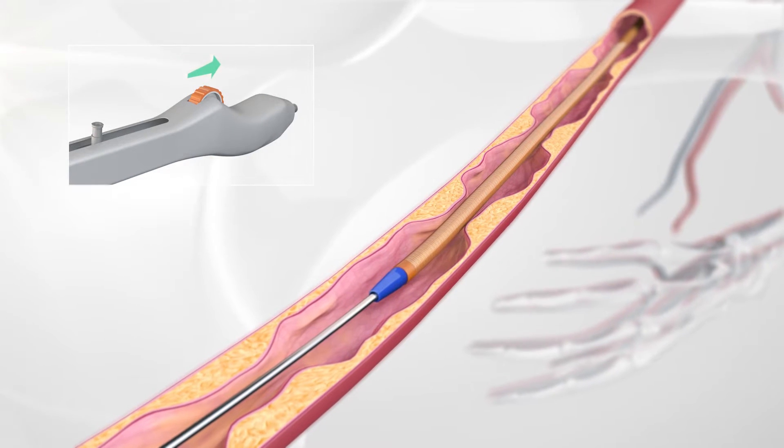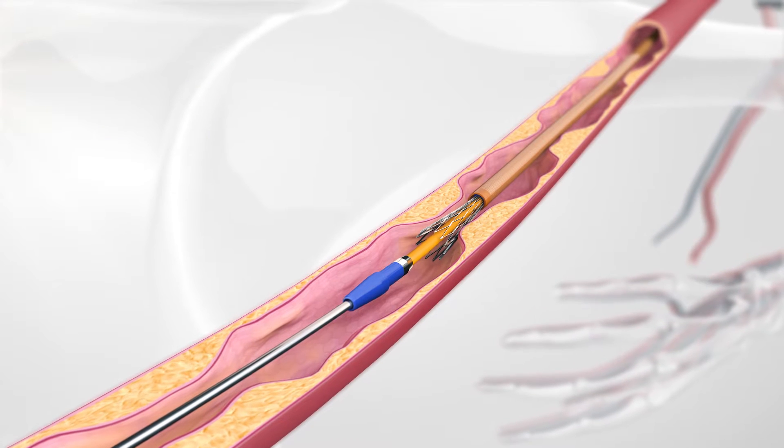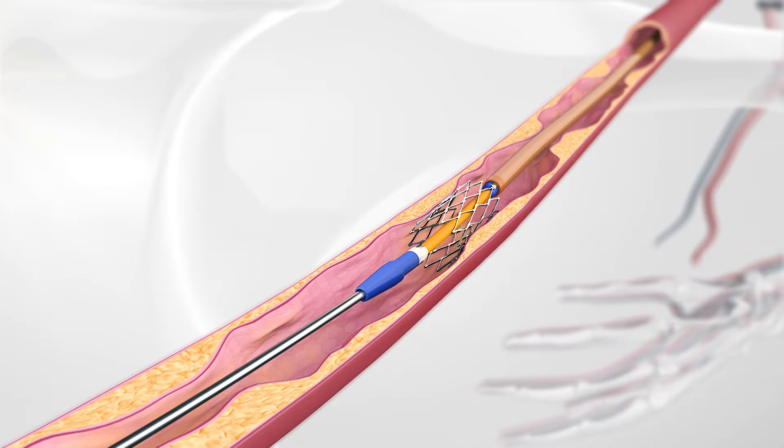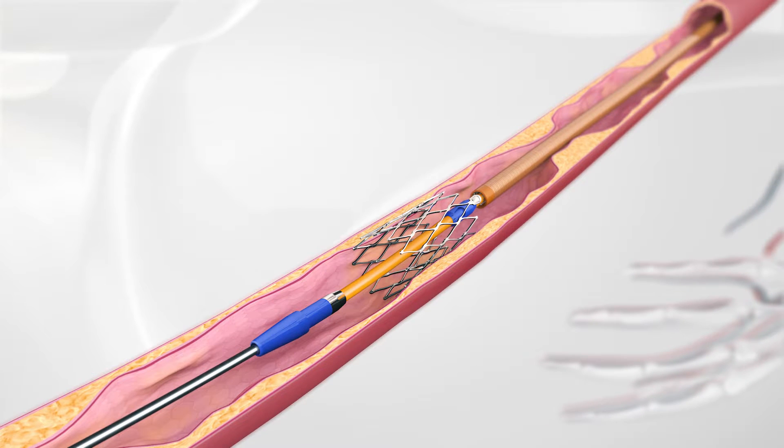By turning the wheel on the handle, the stent is released into the lesion of the vessel. The stent is completely released once the marker band is unlocked from the mount point.